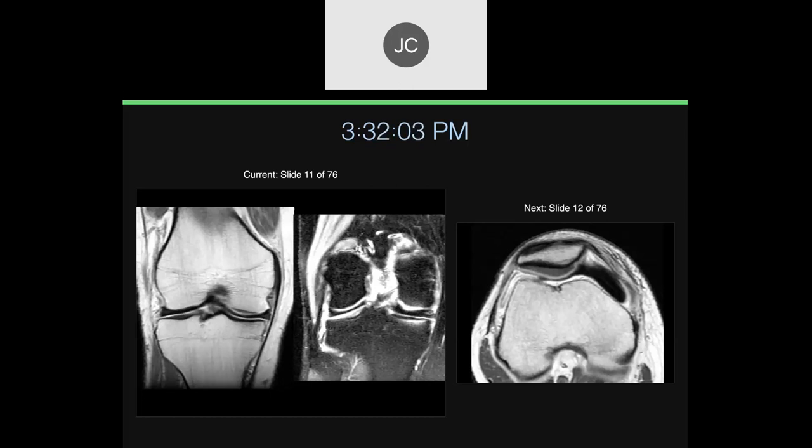It doesn't really stop like a meniscus does. This is someone who had an MR arthrogram of the knee — this is what the images look like when the contrast is too concentrated. If you put gadolinium in at too high a concentration, it causes dephasing of the spins right away, and you get no signal intensity on any of the pulse sequences.